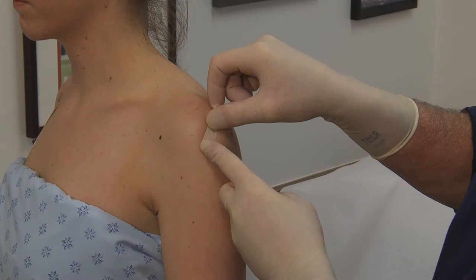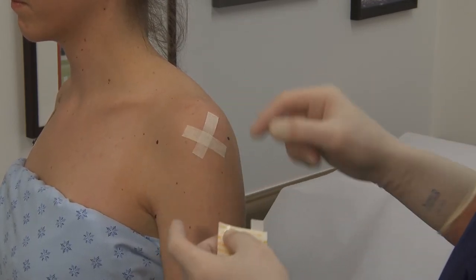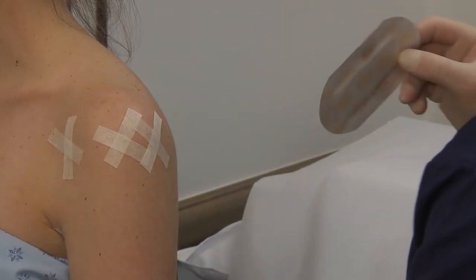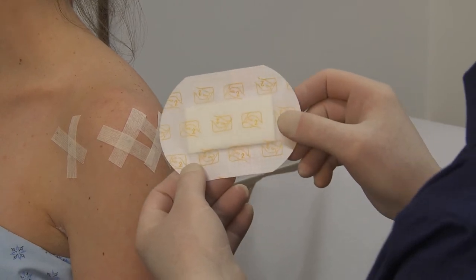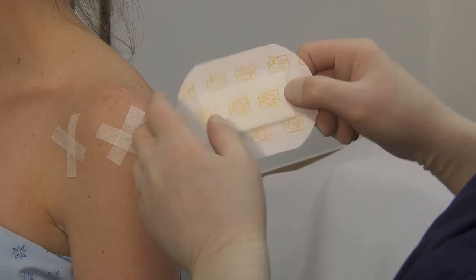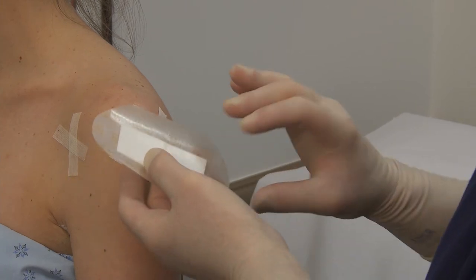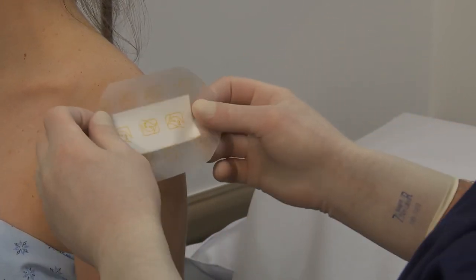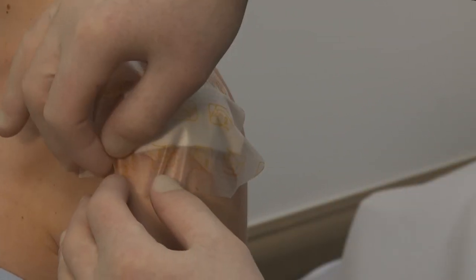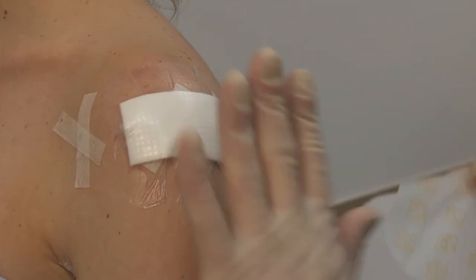All of the incisions will be secured with SteriStrips. The SteriStrips should stay on for two weeks. On postoperative day one, we will replace your surgical dressing with op sites. You will be provided with a 10 to 14 day supply of op sites. When applying the dressing, you will notice there is a one and a two on the op site. Simply remove side one and place over as many portals as possible. Then remove side two, which leaves a flexible, watertight dressing. These should be changed every other day.